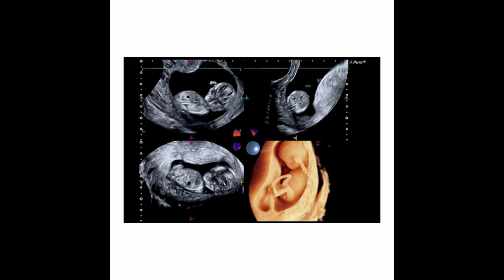As far as 3D imaging goes and diagnostic value, in the fetal setting, we don't really have much for it. We might use it to take a look at the lips. We might use it to take a look at the spine. But beyond that, 2D imaging is really going to be more diagnostic. In the cardiac setting, again, we can look at the valves moving in real time, which is actually pretty neat. You can see how well they're closing and opening and how the leaflets are activating together and coming together in just a different view than you can get in 2D. But again, we're still really limited on the diagnostic value of 3D imaging in most of our ultrasound applications.